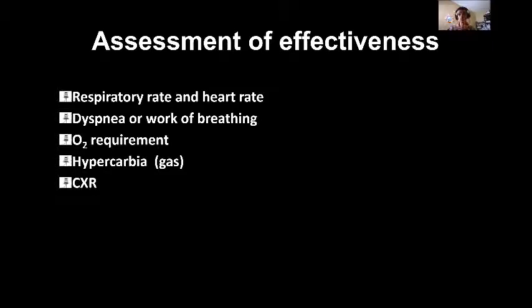Of course, not all patients need 15 when you require it. It depends on your FiO2, your work of breathing, and the patient's tolerance. But I mean 15, or 1.5 kilopascals, as the centimeters of water level of CPAP. 15 in a newborn, in a premature baby. Yes, 1.5 in a premature baby. And that's what I call CPAPophobia.